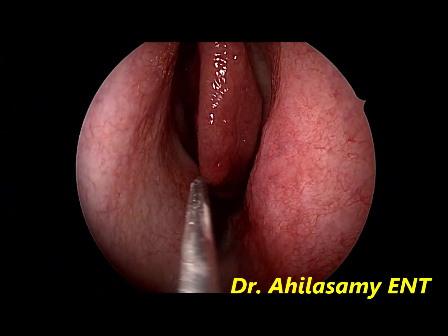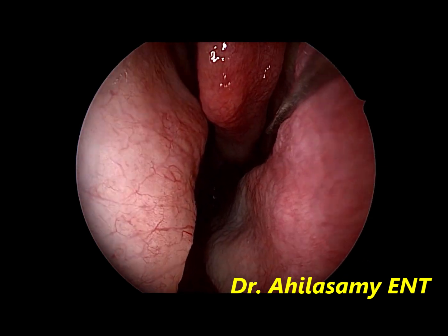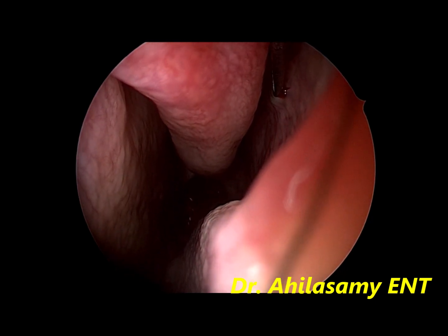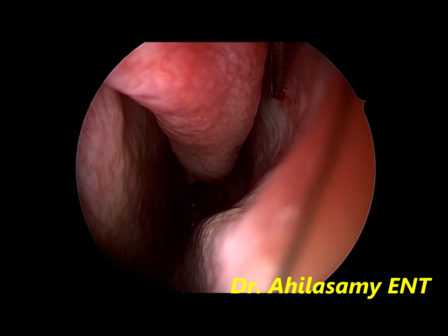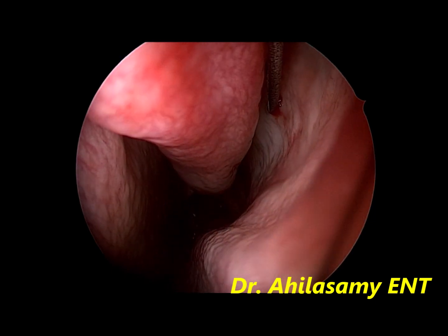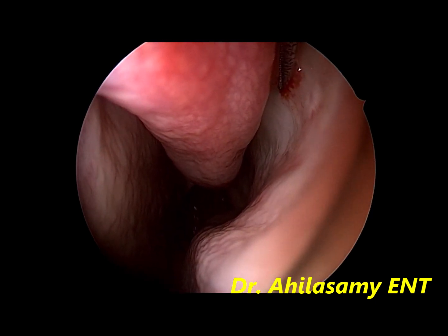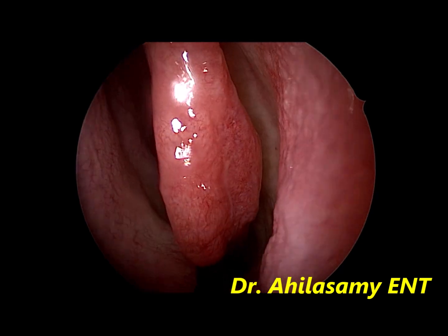Now the sphenopalatine block is being given on the left side, where the middle turbinate attaches laterally. You can appreciate the blanching very well. Always aspirate, because it is a very vascular area where the sphenopalatine vessel also comes. You can appreciate a good blanching — that is the sphenopalatine block on the left side.